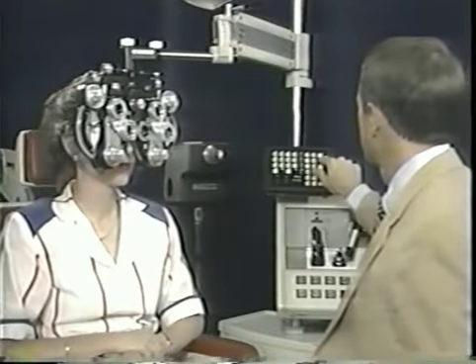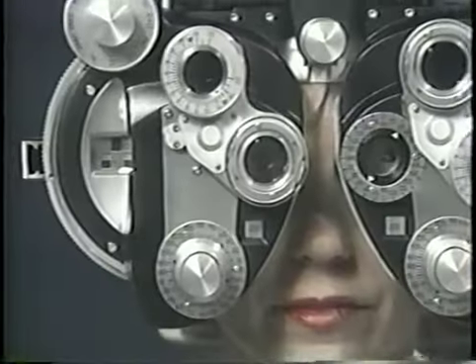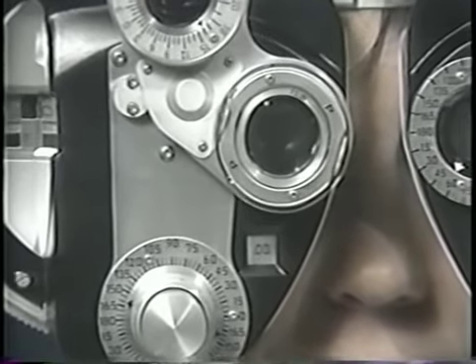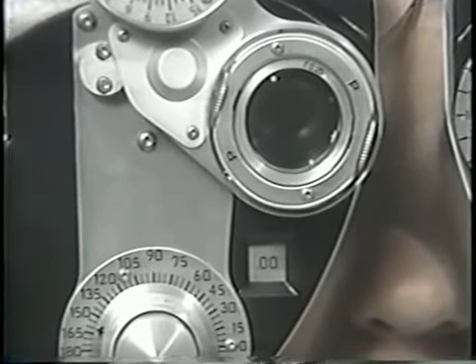The cross cylinder will decrease the patient's vision, typically by 1 or 2 lines when it is introduced. It is thus important to be sure the patient has adequate sized letters to see during cross cylinder testing, usually 1 or 2 lines larger than the best vision obtained from adjustment of sphere. If a previous correction is in place, cylinder axis is refined first, followed by cylinder power.